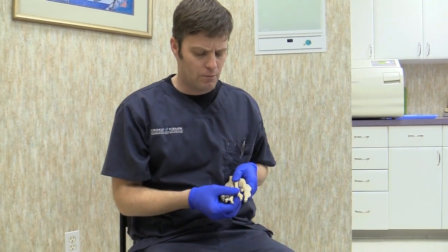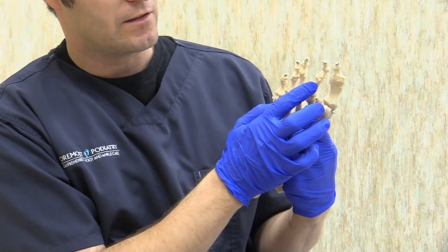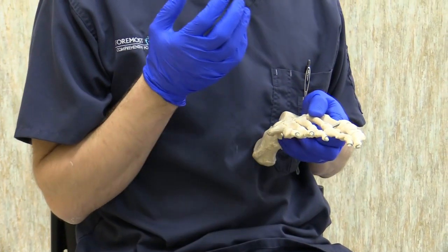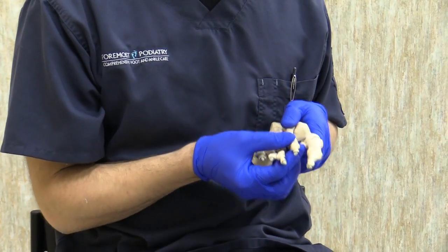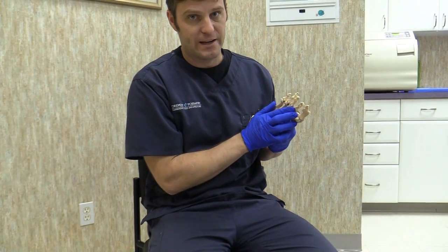Typically what we're trying to do is stabilize the plantar ligament that connects the toe to the metatarsal. That can be known as metatarsalgia, or oftentimes we might refer to it as pre-dislocation syndrome. This can be used sometimes after surgery to stabilize a toe, but more commonly it's when you have chronic injuries to the joint.